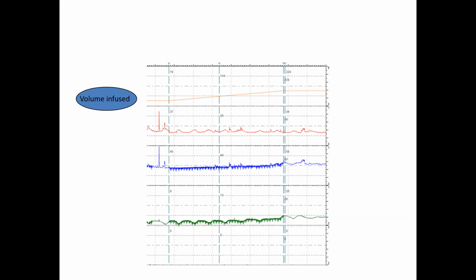In some patients, however, they do have true issues with their compliance, and therefore once you leave the filling rate off for 2 minutes and it's maintained, you can be more confident about those changes in that patient's compliance. So the artifact there would be if you fill too quickly in some patients, you may see changes in their compliance, which wouldn't be there normally. So a couple of artifacts there: your rectal contractions, your pump artifact, and this change in compliance.